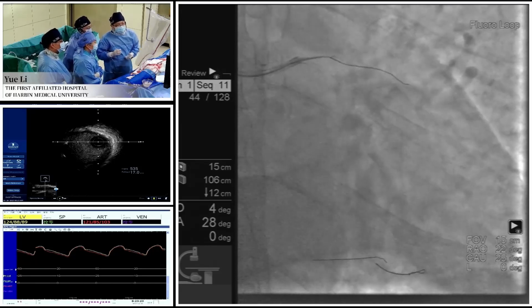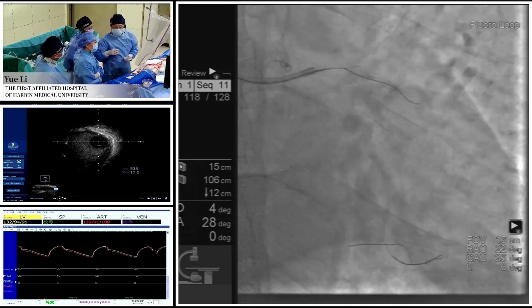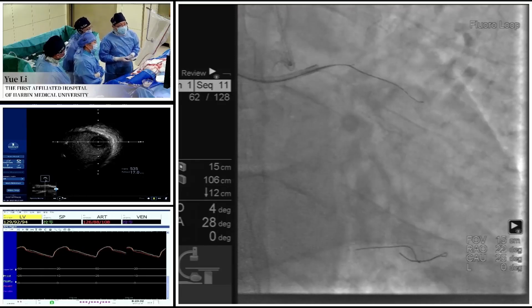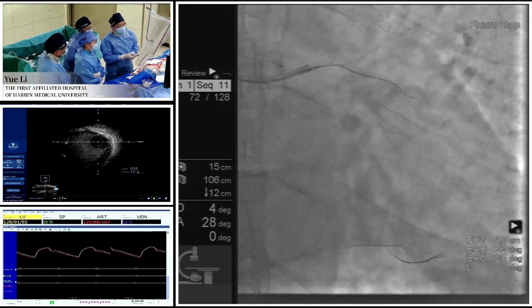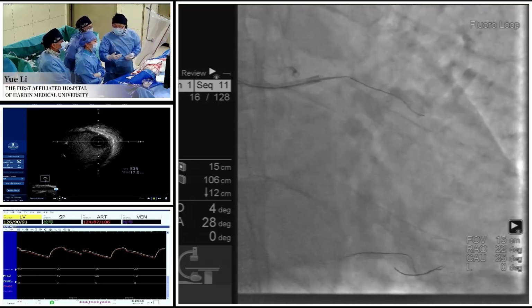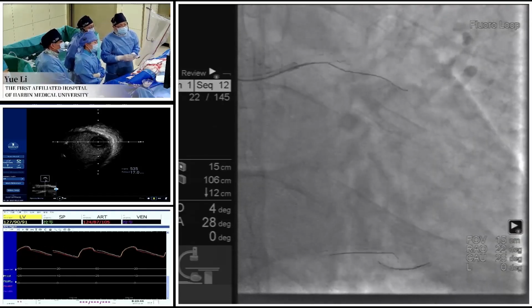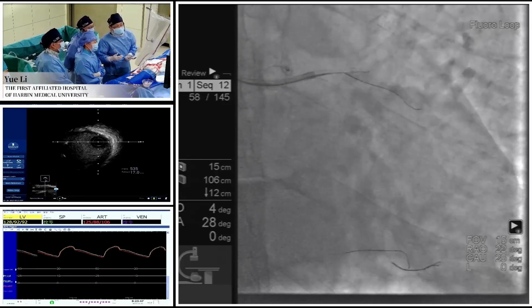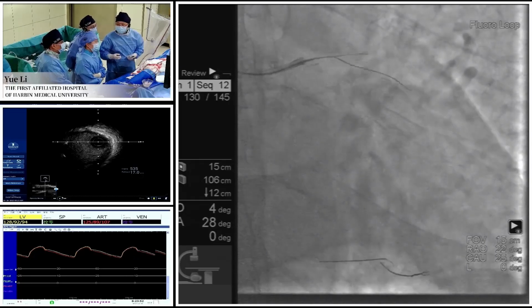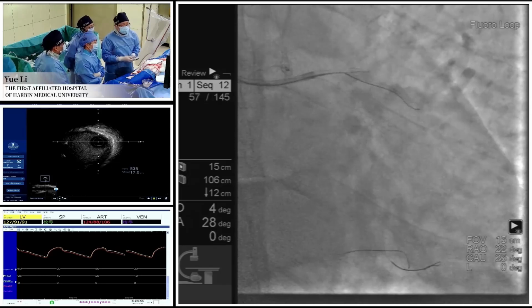Fielder XTA is a hydrophilic tapered-tip wire and sometimes could be used to cross microchannels in loose tissue tracking. And we can see from the angiogram that the Fielder XTA could be relatively easily advanced a little bit further. Then we advance the Corsair microcatheter a little bit to increase the backup support. But we found the plug still has resistance, and the Corsair microcatheter couldn't be advanced.